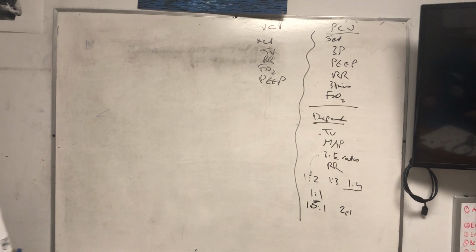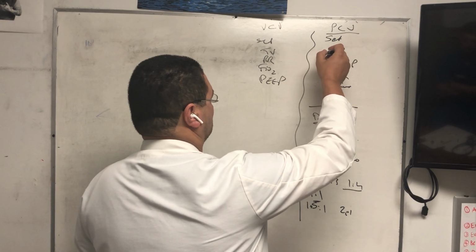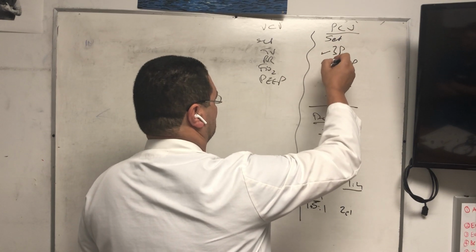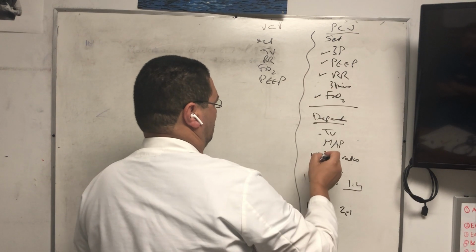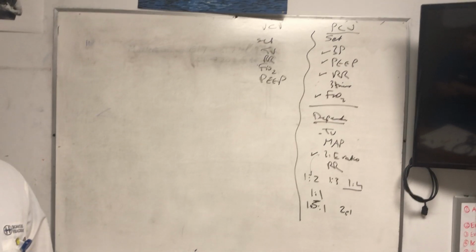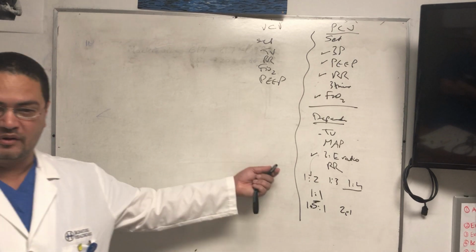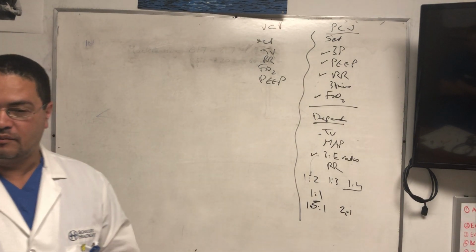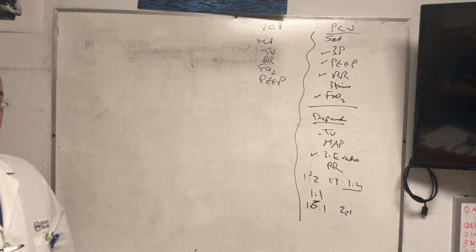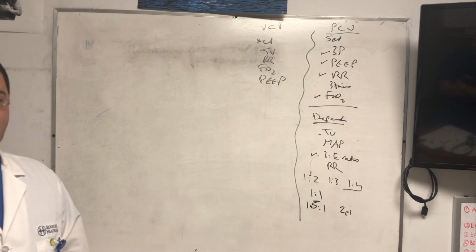It's not really a myth, but it's kind of an idiosyncrasy, a rule that we made. When we order pressure control, we don't order the I time. That's the only mode of ventilation where we order the dependent parameters. Usually we order set parameters. We never order dependent parameters except in this mode, right? And that's for safety, because you're saying to the respiratory therapist, I want the patient to be at a 1-to-1 I to E ratio. Do whatever it takes to keep the patient at a 1-to-1 I to E ratio.